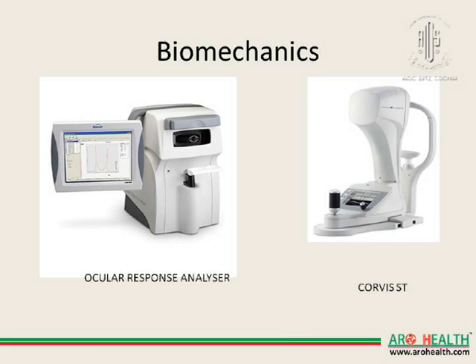So this is all we have dealt with regarding imaging. Now what next? How to measure the strength of the cornea? We know that there is weakening of the cornea, but how much weakening? Do you know that? Do you have an objective assessment of that?